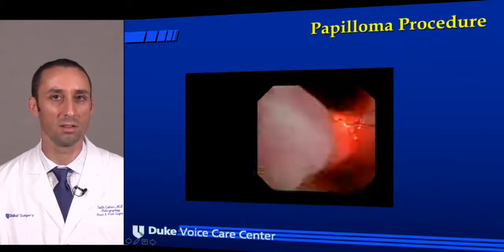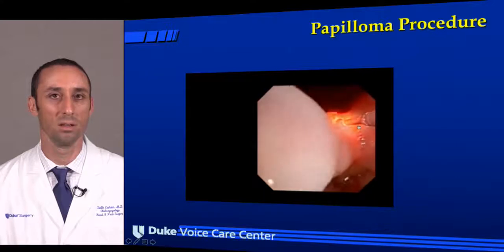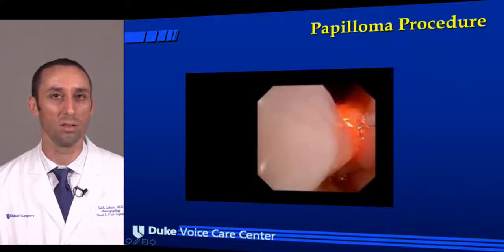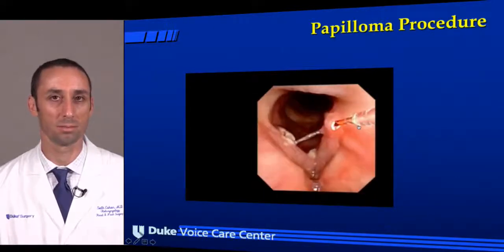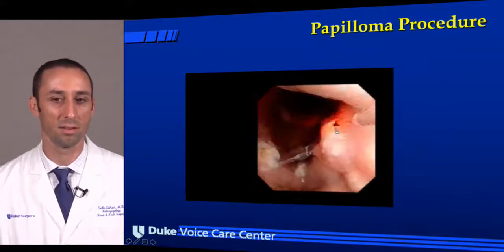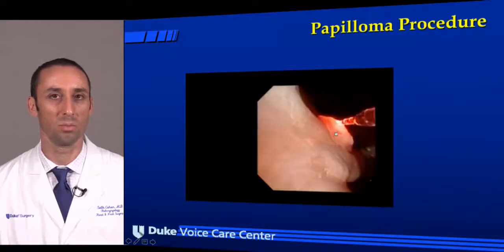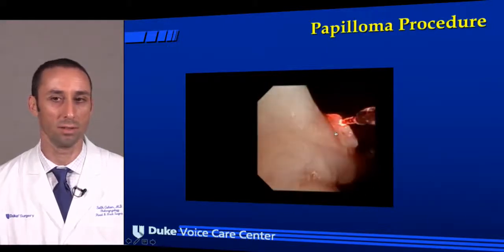You have to do the same laser safety precautions that you do as somebody in the operating room. Everybody's wearing protective eyewear. There's mirrors in the room. You have to make sure that you cover the mirrors. I have suction active always as I'm doing this. And you have to make sure that your eyewear is appropriate for the wavelength that you're using.